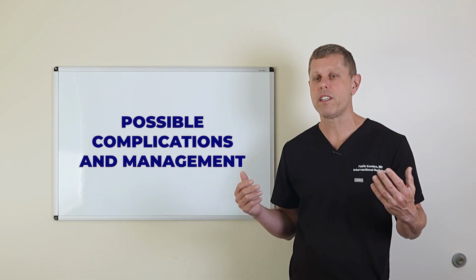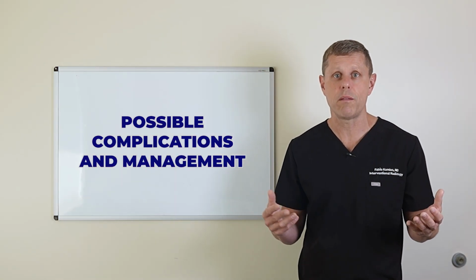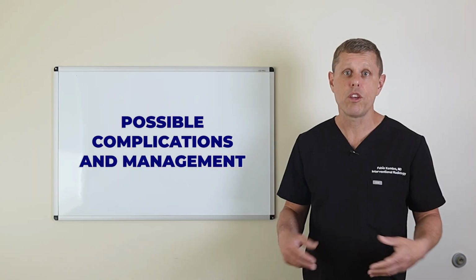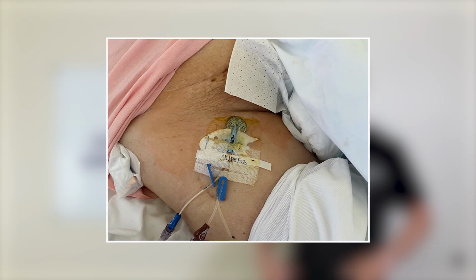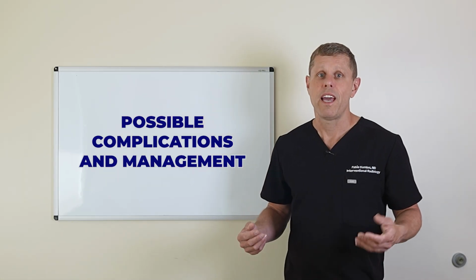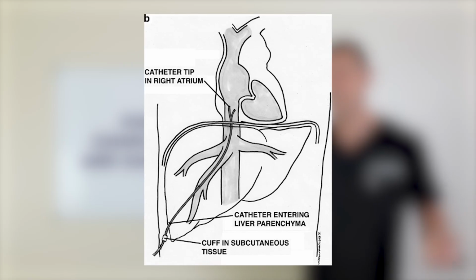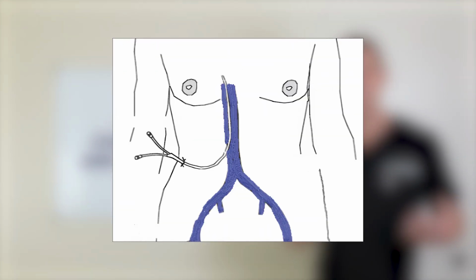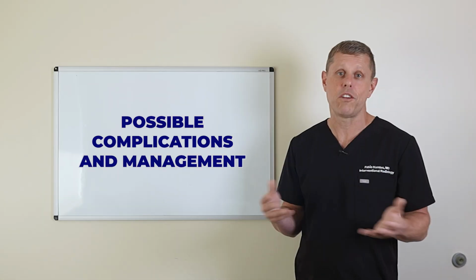And I've seen patients in the past that run out of veins in the arms and in the neck, and you cannot put a catheter here. And then you may try to do a groin catheter. Those are more tricky because they tend to get infected more often. And I've seen some patients requiring a catheter going in a vein in the liver, for example, for TPN, or even having a catheter placed directly into the inferior vena cava to get the treatment that they need.